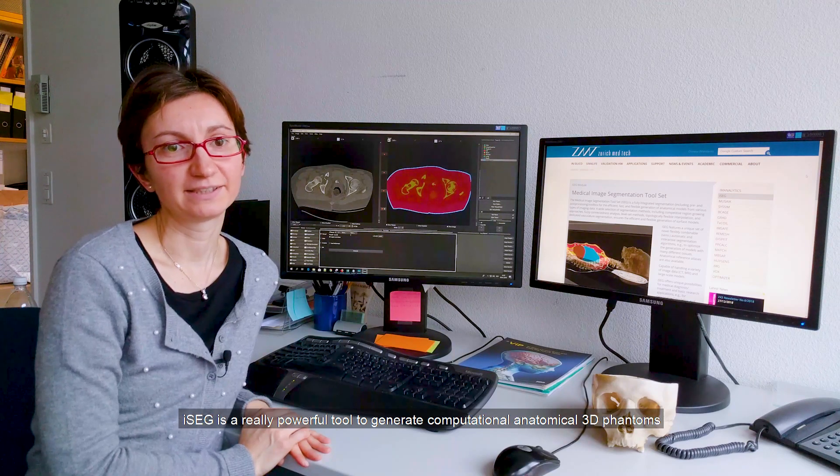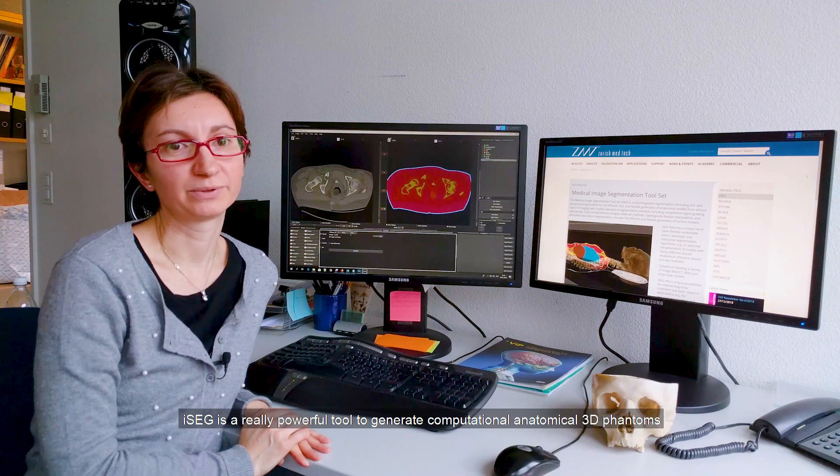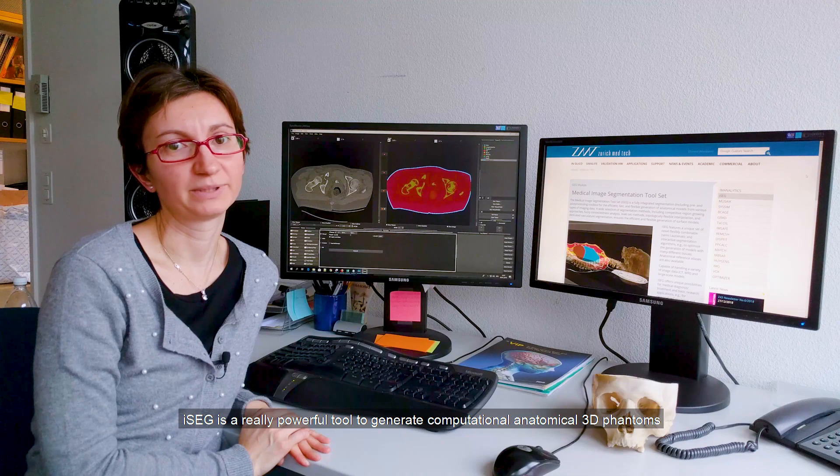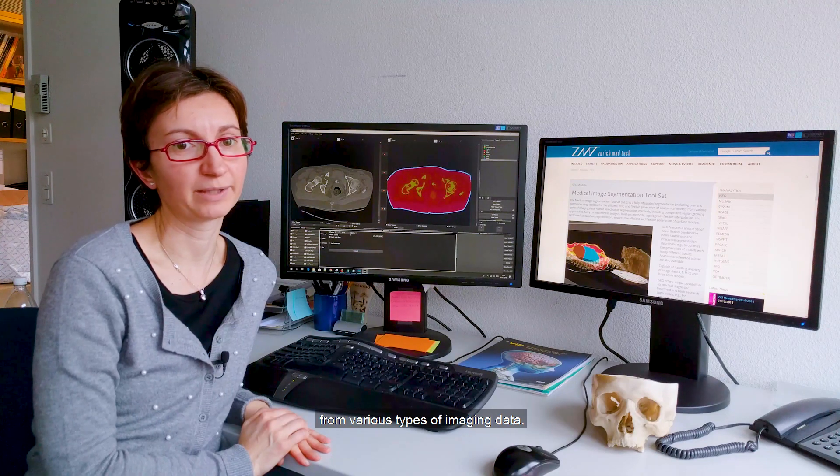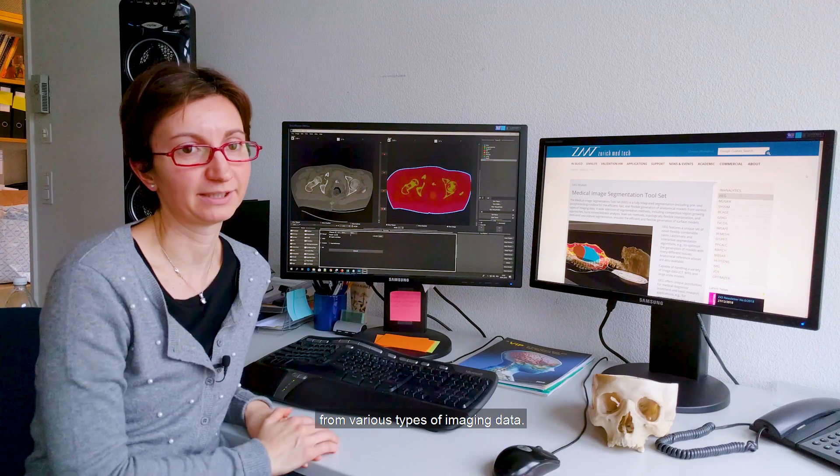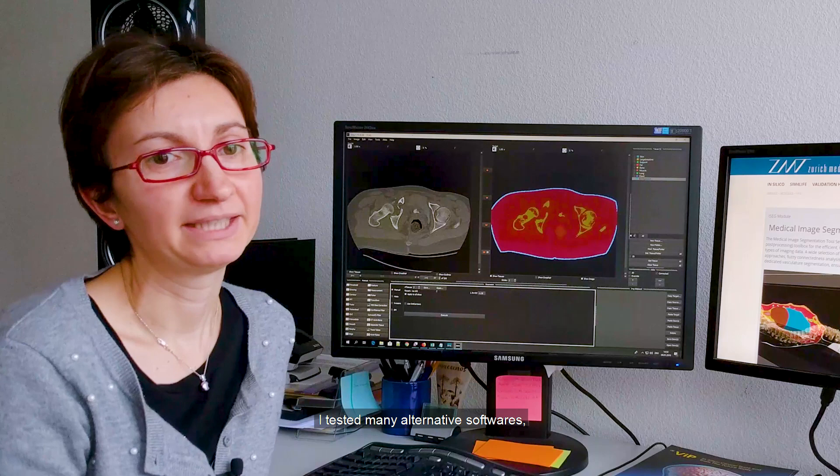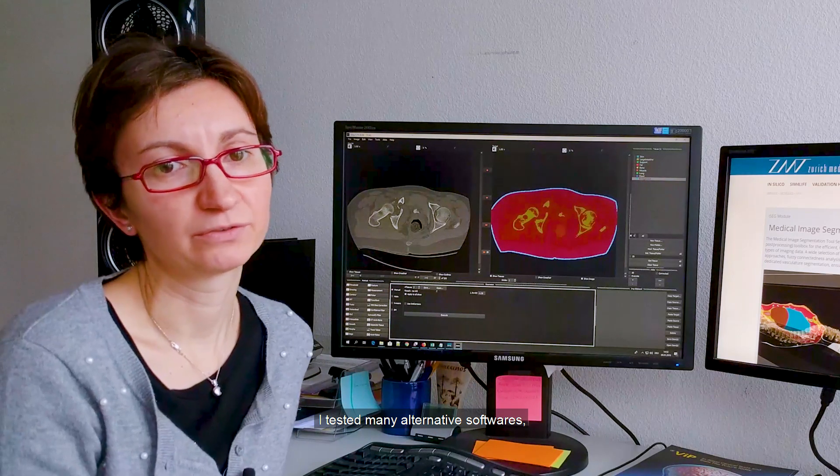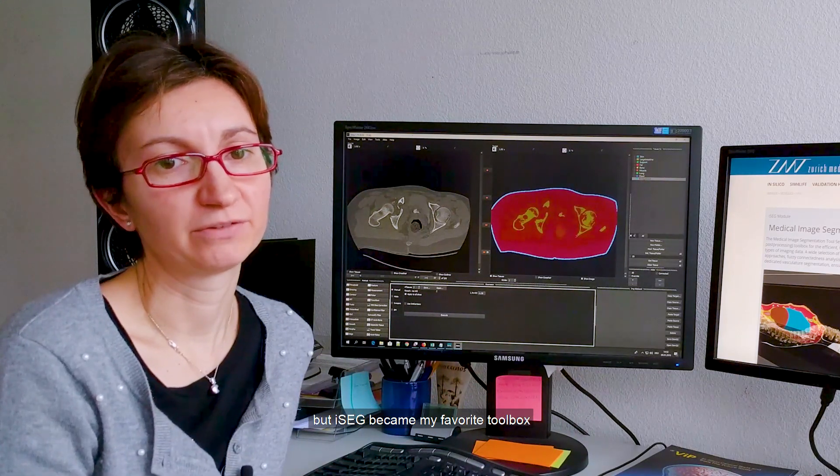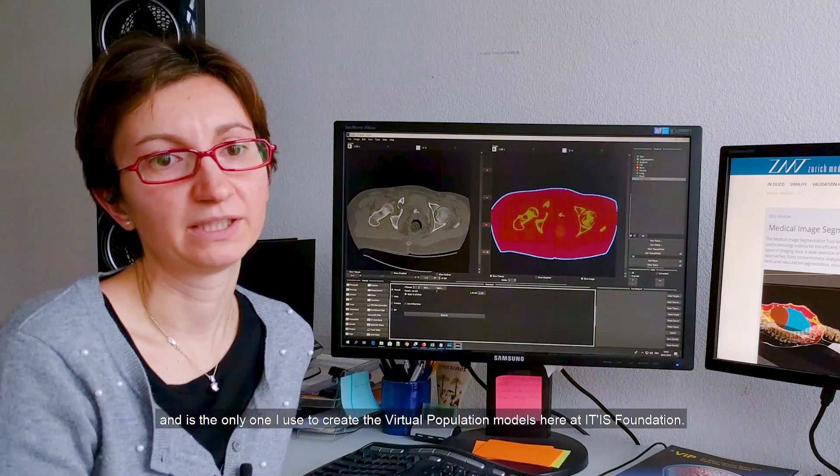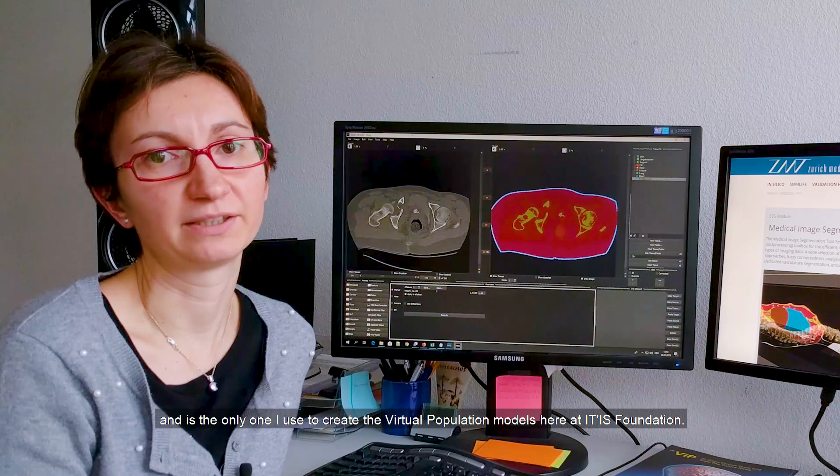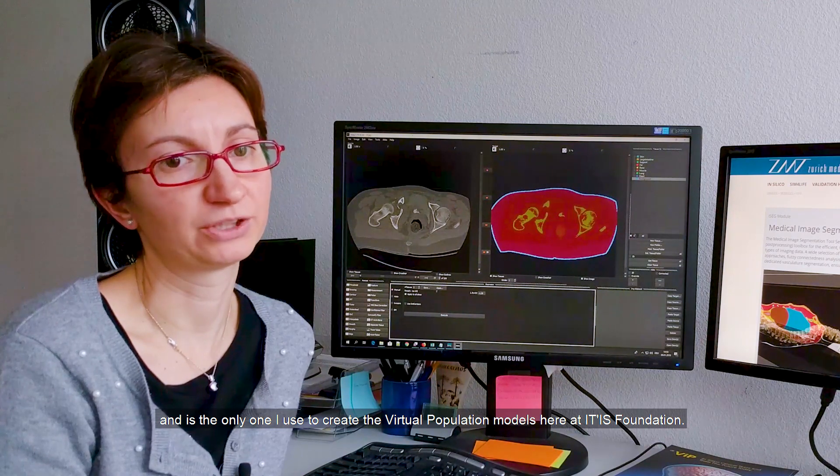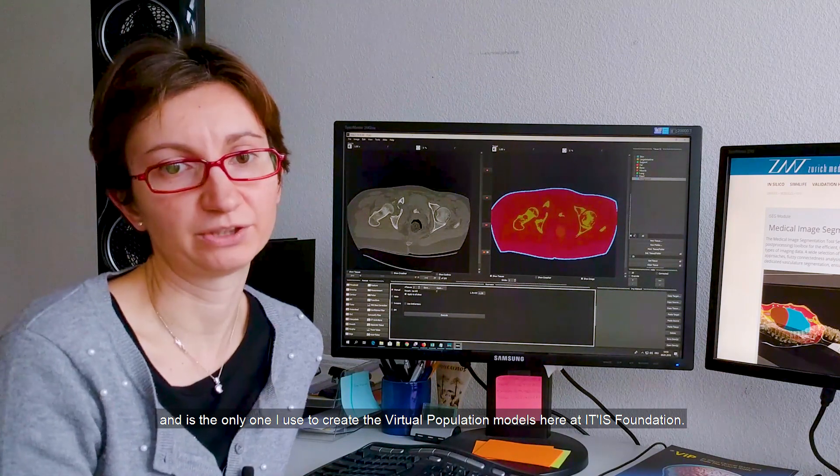iSEG is a really powerful tool to generate computational anatomical 3D phantoms from various types of imaging data. I tested many alternative softwares, but iSEG became my favorite toolbox and is the only one I used to create the virtual population models here at IT'IS Foundation.